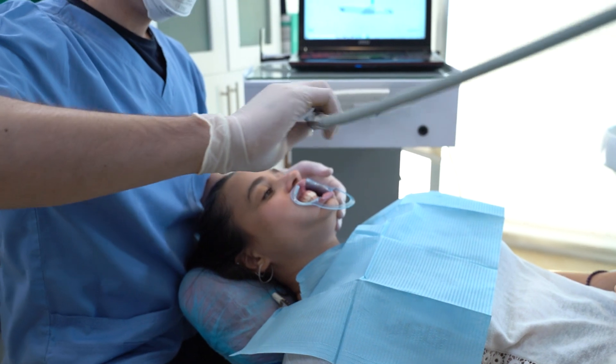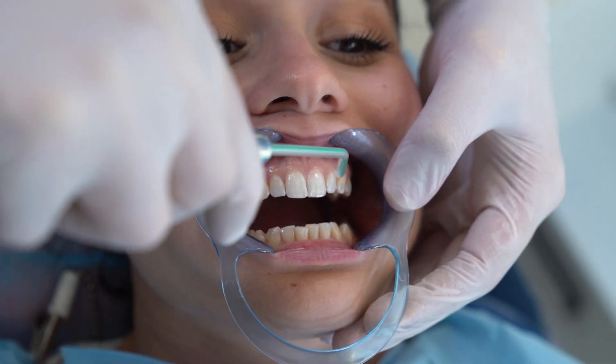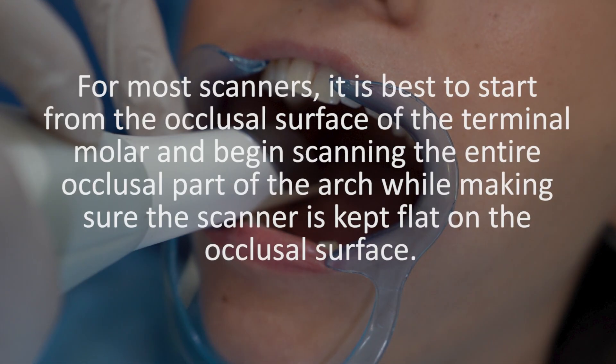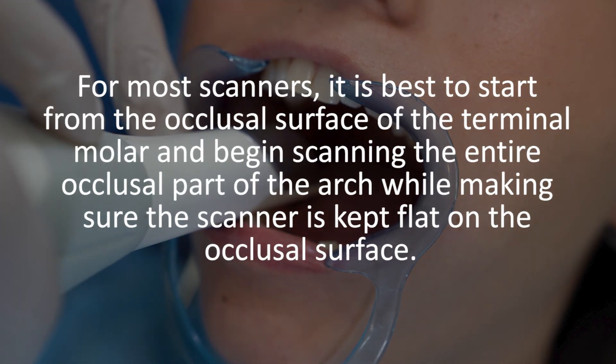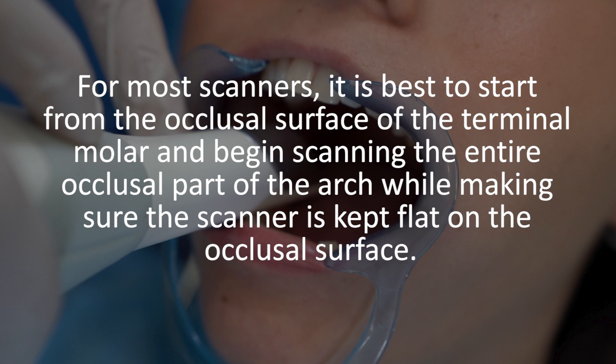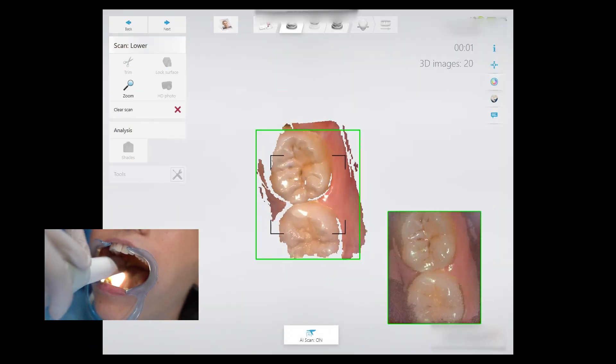Sit behind the patient for best control, dry the patient's teeth, and start scanning the lower arch. For most scanners, it is best to start from the occlusal surface of the terminal molar and begin scanning the entire occlusal part of the arch, making sure the scanner is kept flat on the occlusal surface.